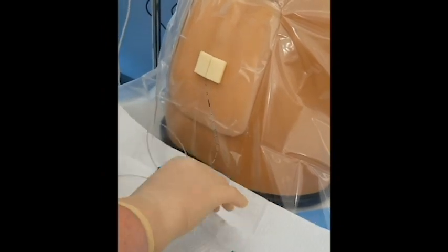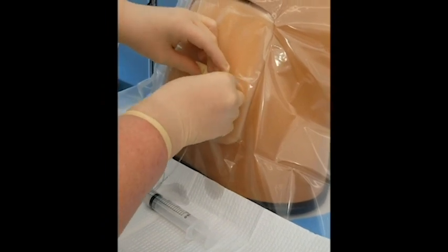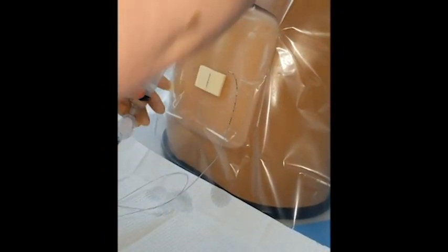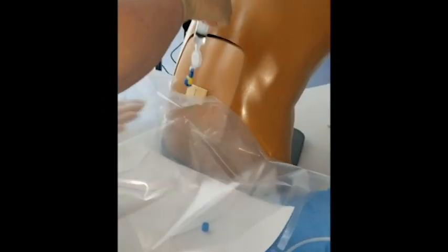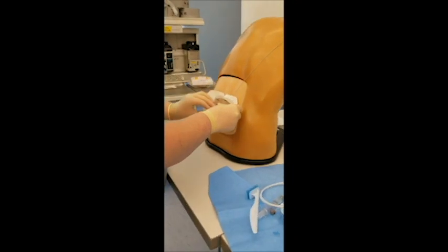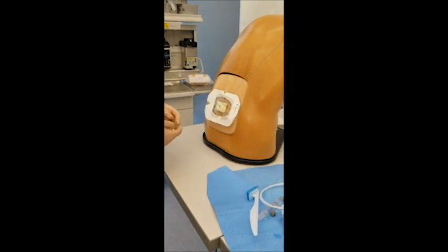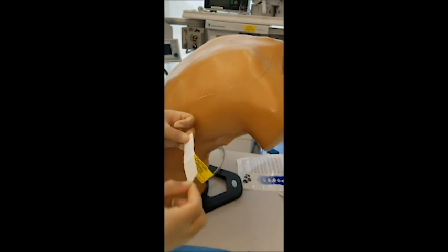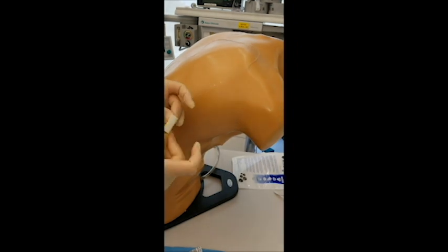Once the stabilizer is in place, go ahead and remove the sterile drape. Place a tegaderm over the catheter. Then you may place tape along the catheter up the back and shoulder. Make sure you mark the epidural catheter with the sticker that was in the kit.